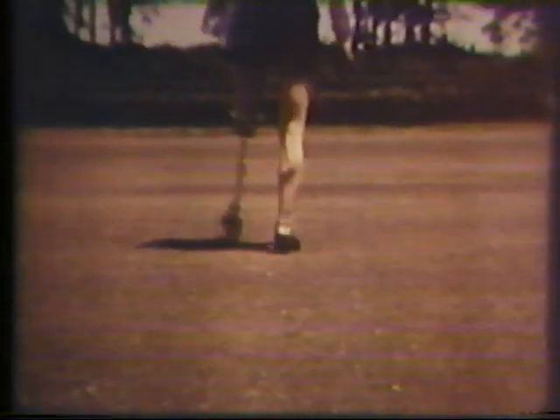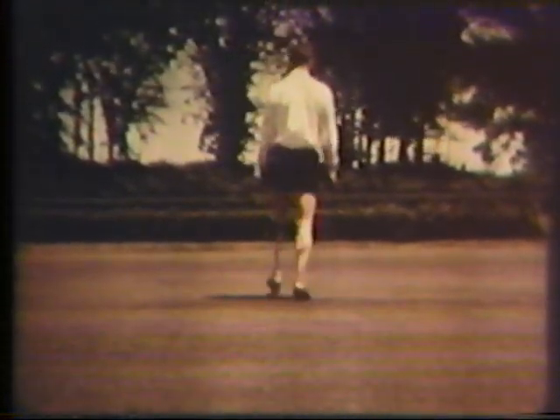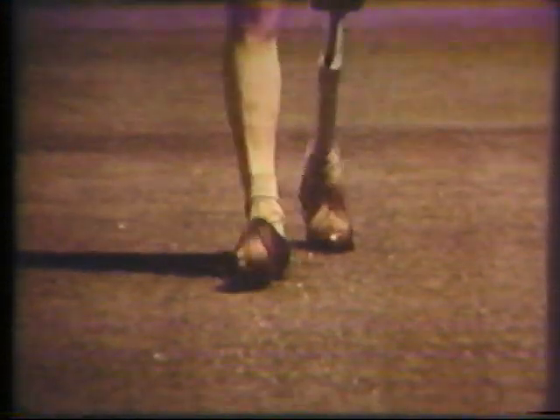This gait is not uncommonly due to an amputee who has poor control of the knee, is reluctant to flex it, and hence by swinging the prosthesis laterally can clear the floor without bending the knee. The patient usually keeps the arm on the amputated side fairly close to the body to maintain balance while the leg swings. If the prosthesis is too long, the patient may swing it to the side to clear the foot. Another common prosthetic cause is a knee which is overly stable due to posterior placement or excessive friction in the knee unit, prohibiting normal swing.